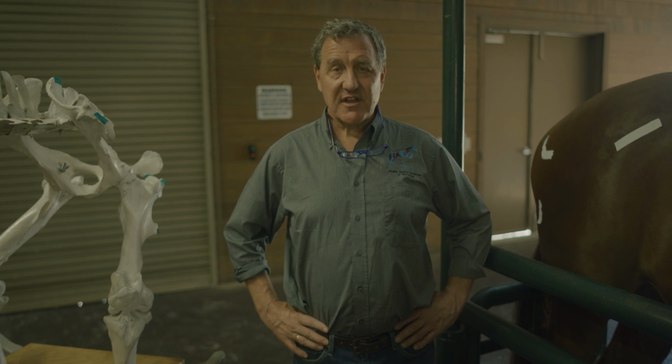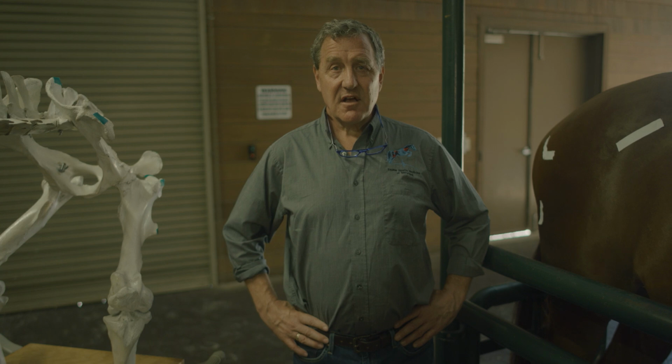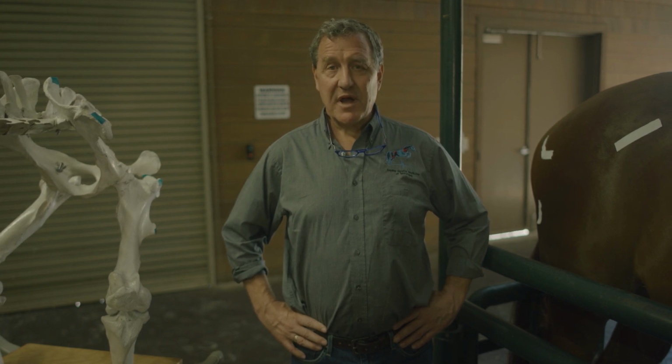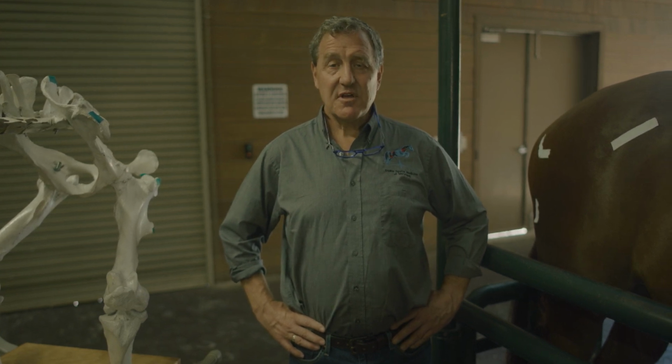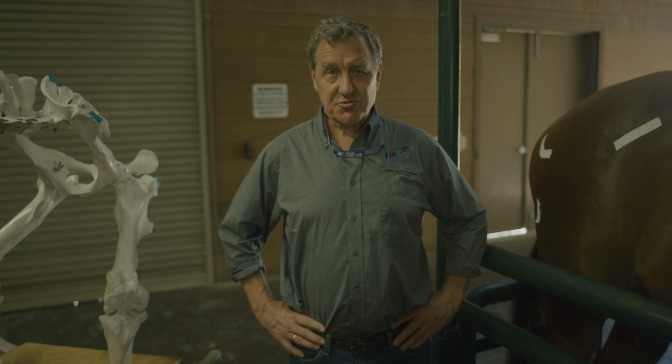And I want you all to think in terms of survey, because you can find a fracture and then stop, and you might be missing the rest of the picture. So you really want to make sure that you sweep the entire pelvis when you're doing external pelvic ultrasound.